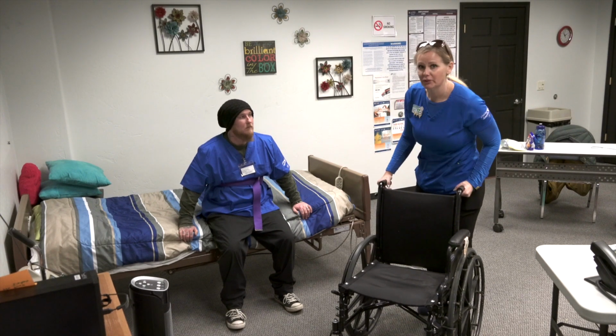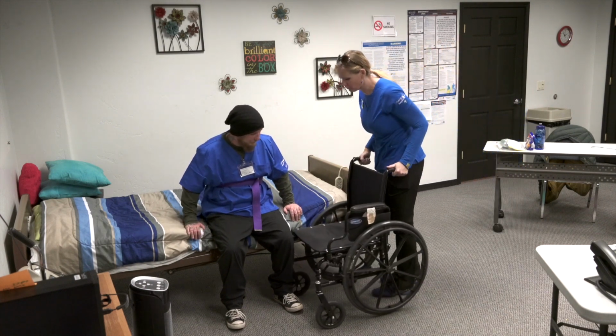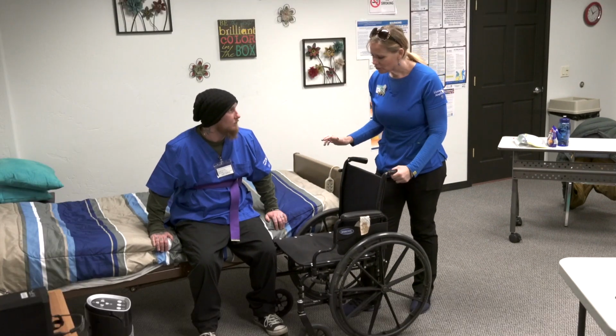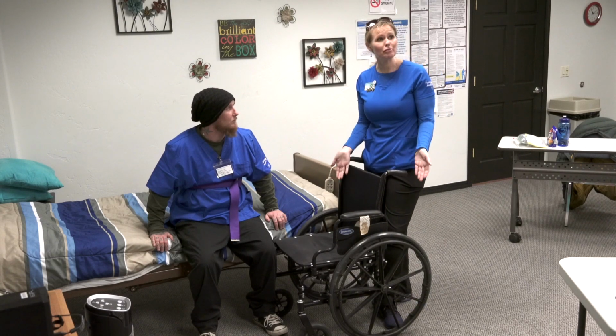Okay, so now we're going to do the pivot transfer, and the first thing you want to do is get your wheelchair in place, and you want it as close to your client as possible. So I'm just going to put it right up to his knee, and then we are going to move the armrest up. With this transfer, it's very important to know we are not lifting them up.